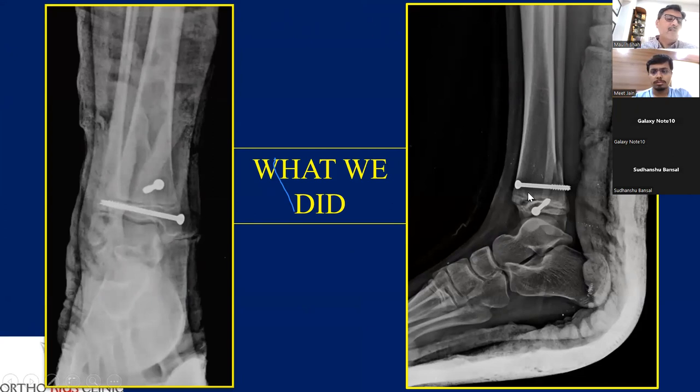Now, when we fixed this epiphyseal screw, the medial malleolus fracture was looking well aligned. And then we passed a metaphyseal screw. We saw that this metaphyseal spike is still lifted. So the compression was not great. So I was not that happy.